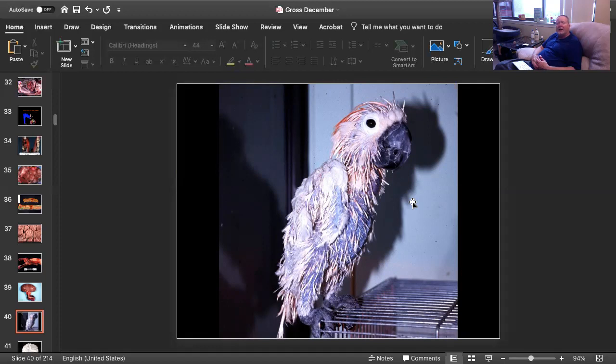And if you look histologically down inside the pulp of the feather, you are going to see macrophages and perhaps some of the feather epithelial cells, which will have very large grape-like or botryoid basophilic inclusions, which are characteristic for circovirus. Boy, this condition went through a whole lot of potential agents until they identified it. I don't want to say porcine, psittacine circovirus a number of times.